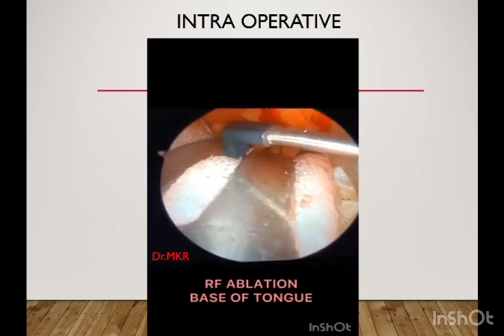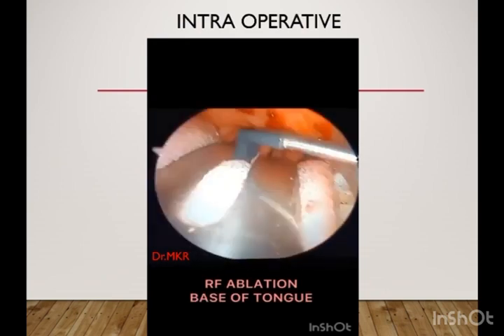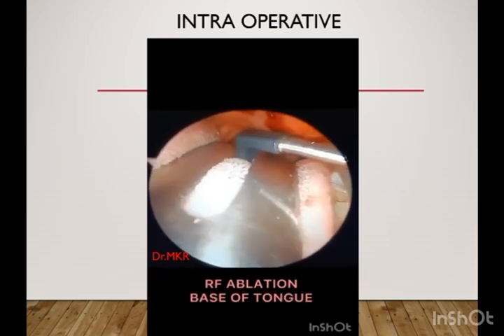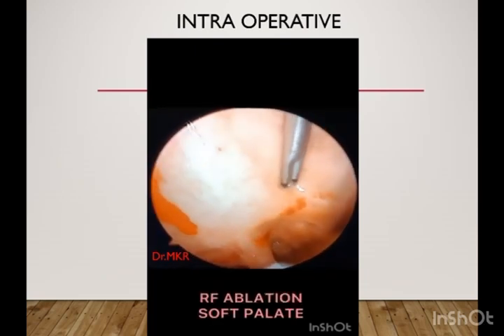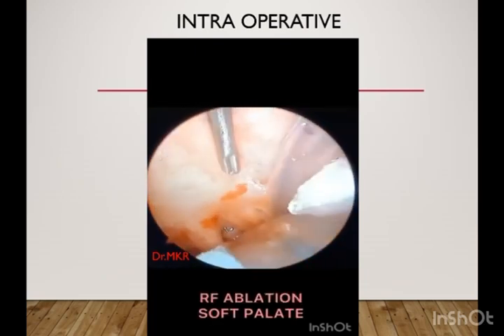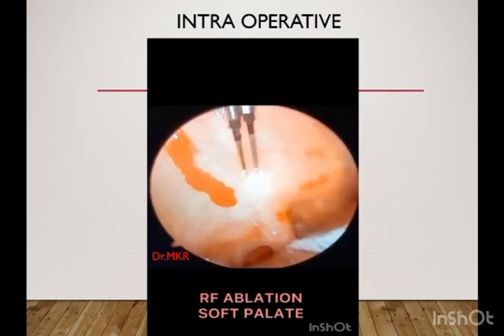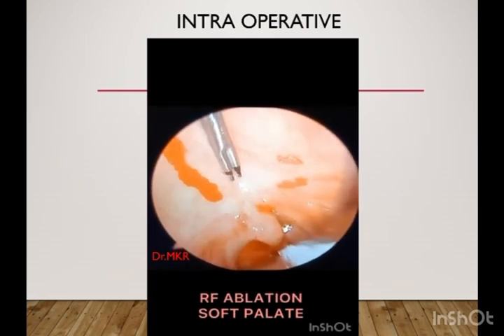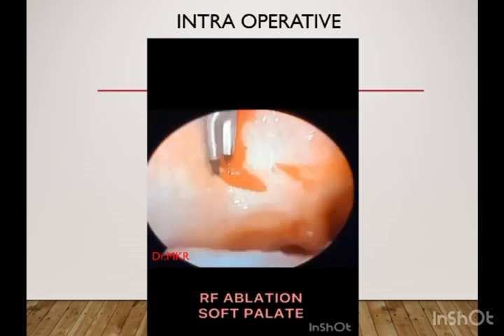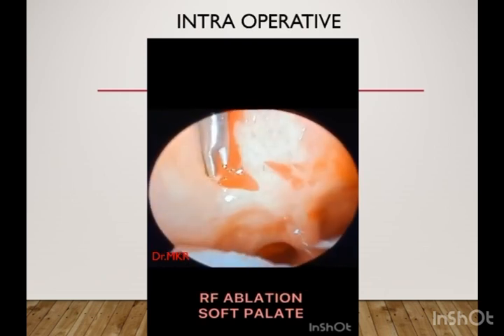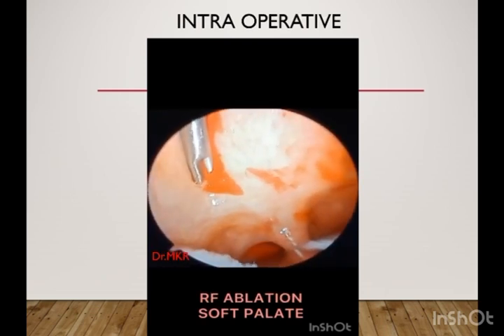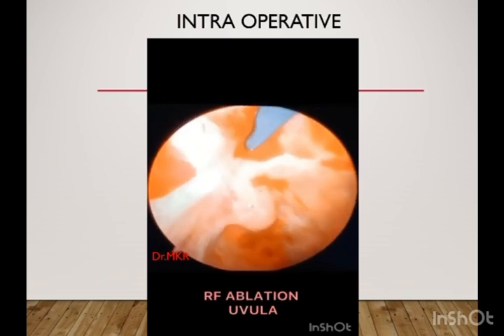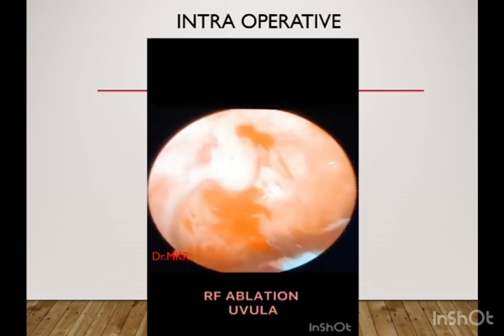It delivers only 70 to 80 degrees Celsius, whereas cautery delivers 400 degrees Celsius and LASER delivers around 600 degrees Celsius. So with Coblation RF, the surrounding structures will not get damaged. Here we are using it over the soft palate on both sides, and over the uvula — you can see the shrinking of the uvula on the table itself.